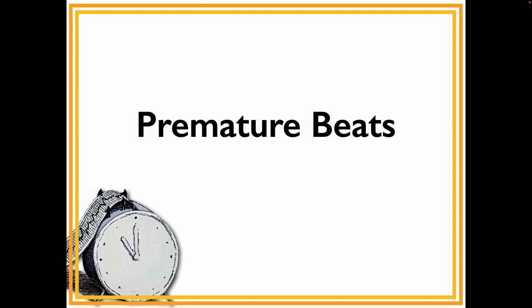And one of the reasons was that the underlying rhythm is regular, made irregular by what I was calling oddball beats, okay? So now we're going to be a little more precise. Rather than saying oddball beats, we're going to come up with what they really are. And most oddball beats, again, that's just my term, are some form of premature early beats.